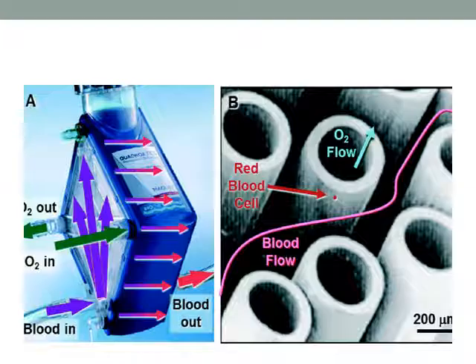So we can run air through it at low pressure, and we have a lot more space out here for the blood to flow. So this is actually a very low pressure circuit where, on a fresh circuit, we can run 4 or 5 liters through it with a pressure drop of only 20 or 25 millimeters of mercury, which is really pretty good. Now that will go up as the circuit gets older, but at the beginning it's really pretty nice.